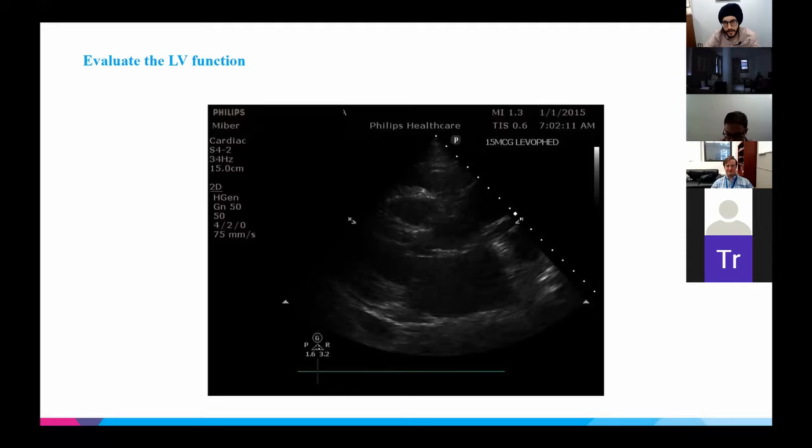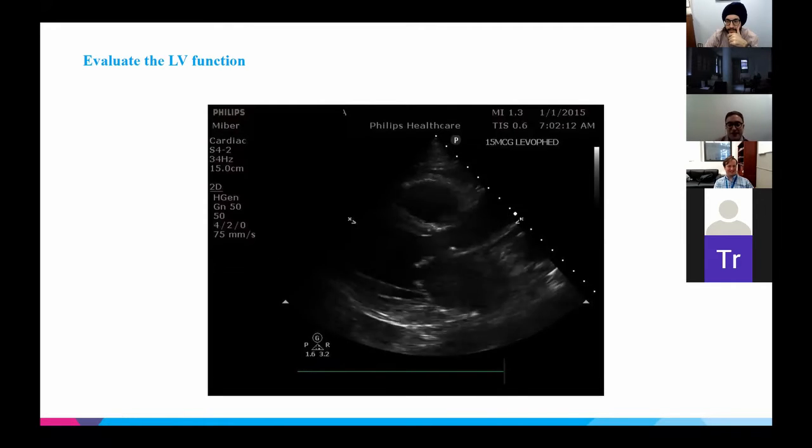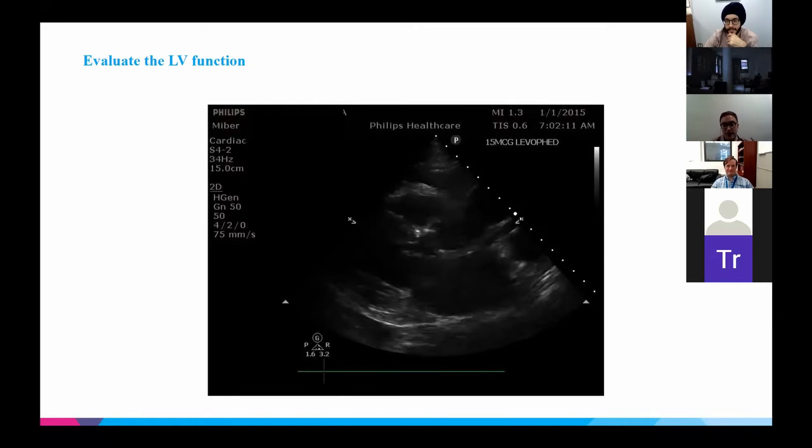All right. So 66% said normal, and then some said hyperdynamic, and then a couple said reduced. So this is, you know, we've asked a few clips and we haven't presented any normal ones. So I wanted to throw that in there. Sometimes when we're doing point of care ultrasound, we want to try and find things that are abnormal or wrong with the patient. But sometimes there are pertinent normals, right? And so this would be an example of someone who has likely normal ejection fraction.